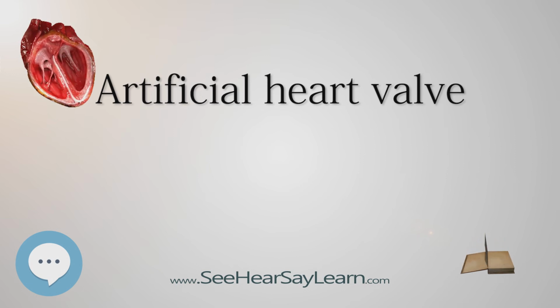Soon after came tilting disc valves. The first clinically available tilting disc valve was the Bjork-Shiley valve and has undergone several significant design changes since its introduction in 1969. Tilting disc valves have a single circular occluder controlled by a metal strut. They are made of a metal ring covered by an ePTFE fabric, into which the suture threads are stitched in order to hold the valve in place.